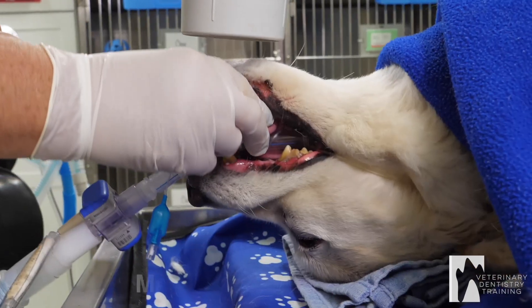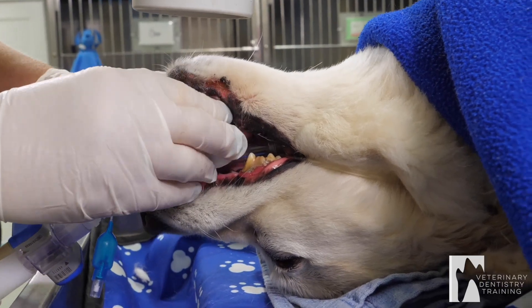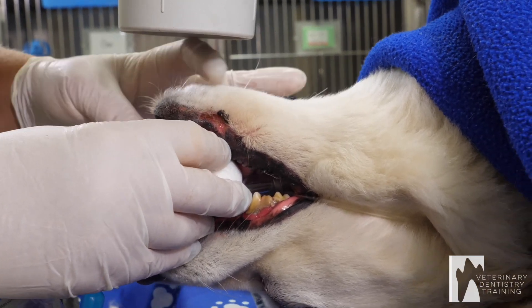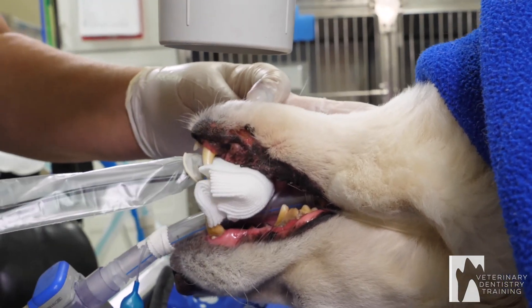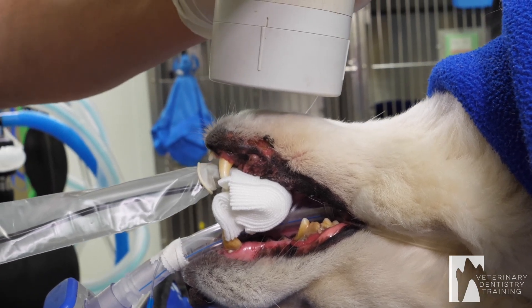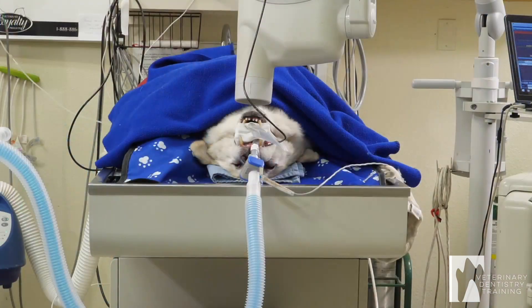I slide the sensor back so the sensor is just at the front of both of those canines. I'm going to center right in between right here and flatten out my angle a little bit like that. This angle is almost parallel to the sensor. I'm going to x-ray.